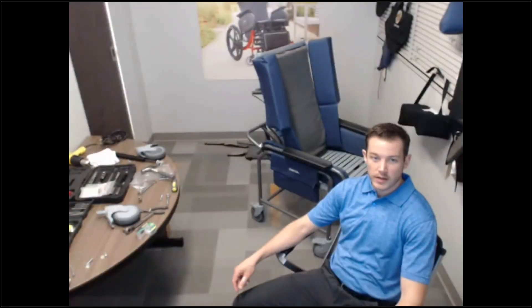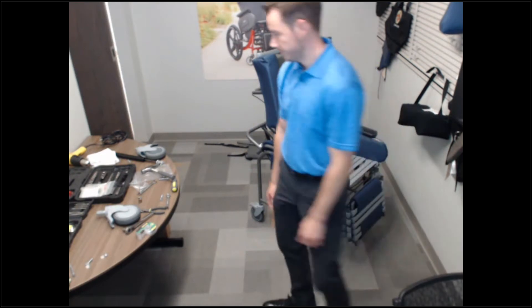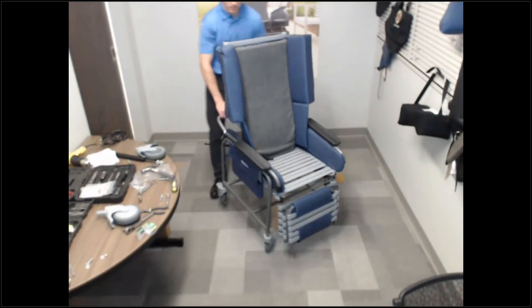Chad Emery again. We're going to replace the casters on the rear of this rota-centric chair. I'll have to turn it upside down to do that. We're going to turn it around.